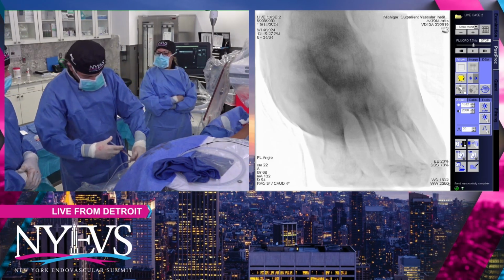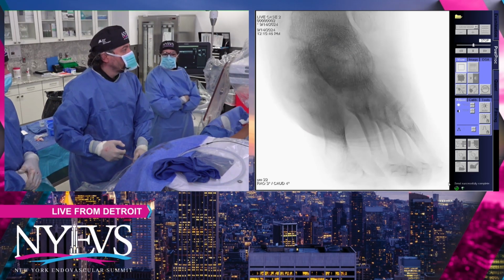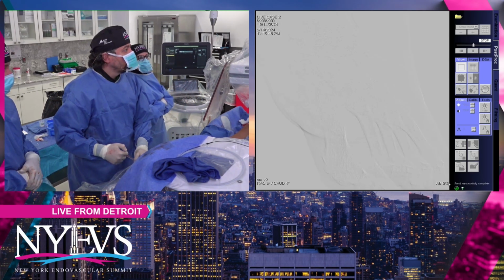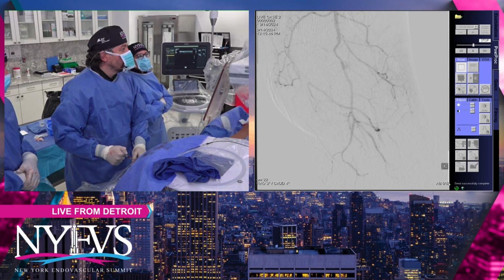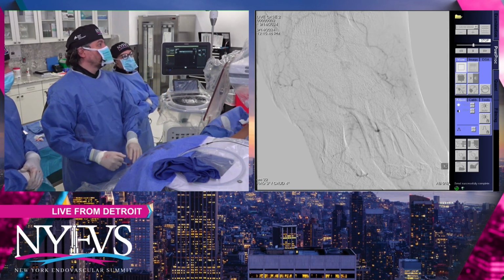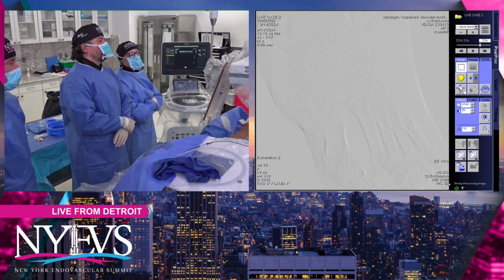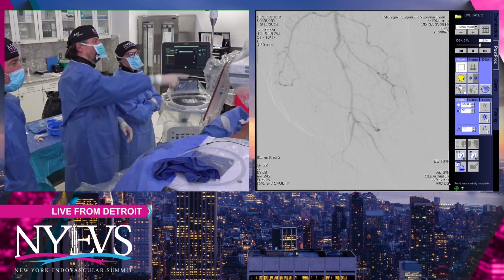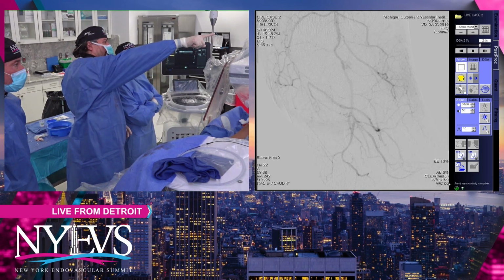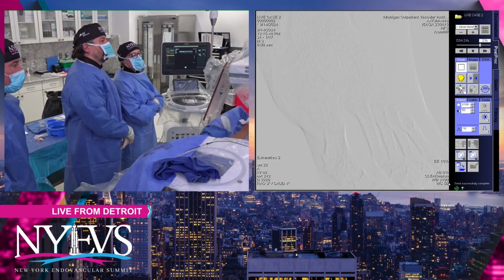I think what we need is a balloon that truly is a dog bone balloon. We need something that doesn't dilate the arch so we don't mess it up, and dilates on either side of that. That would maintain the arch so we don't have a dissection there, because that location is the one thing that's going to salvage the foot in the future. And if he has to rework on it, it's the thing that won't be lost. You get flow from the medial malleolar branch.